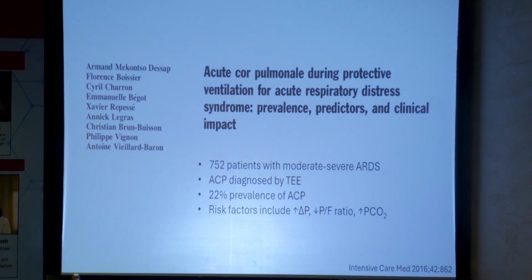So there is no need. Well, we commonly have a situation where somebody has ECMO cannulas in and develops bacteremia, and then the infectious disease doctors come by and say, "Oh, just please remove and replace all the central lines."